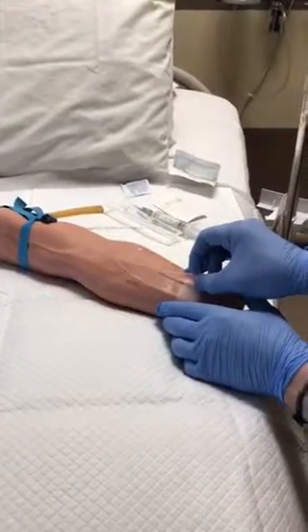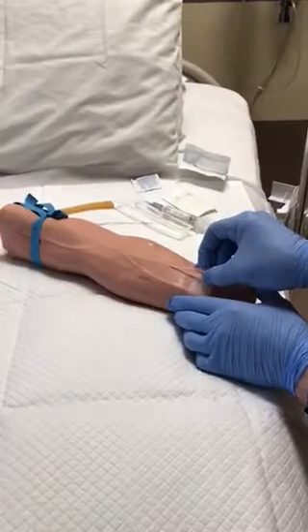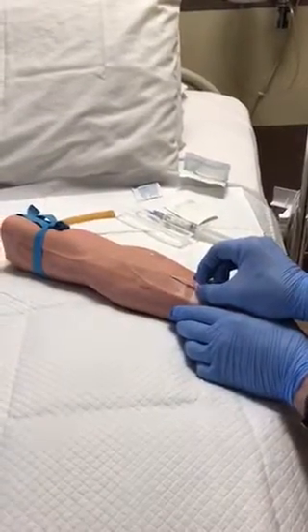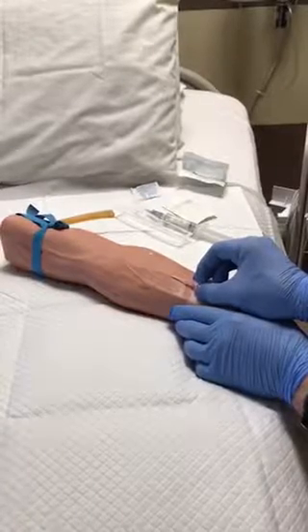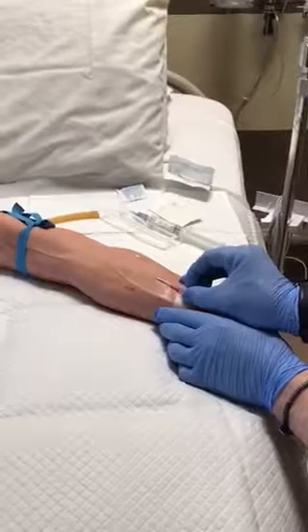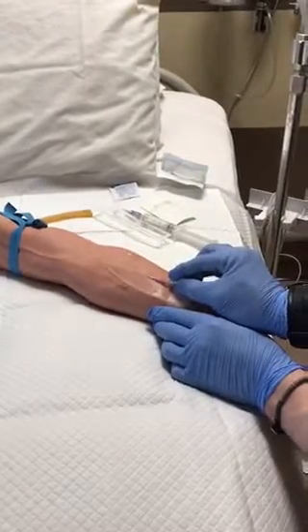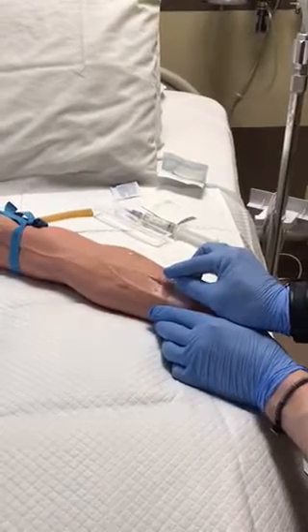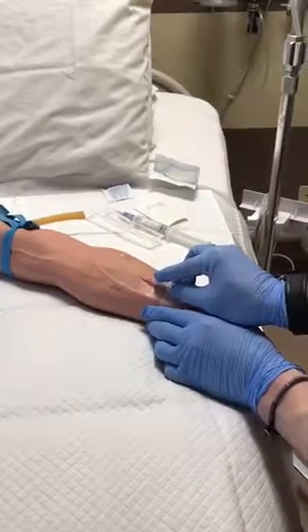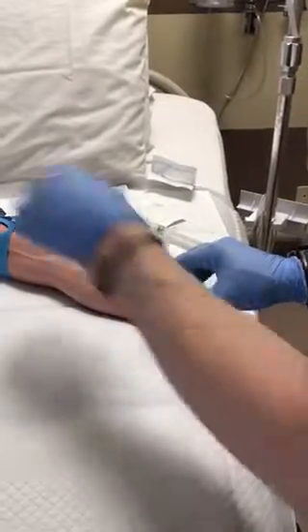Like that at a 10 to 30 degree angle. Going to introduce the catheter. And I'm going to look for flash. Our practice arm does not unfortunately flash, so I just got flash, drop the hub down as I stabilize the skin, thread the catheter forward to the skin, and these catheters I can go ahead and pull that all the way out.